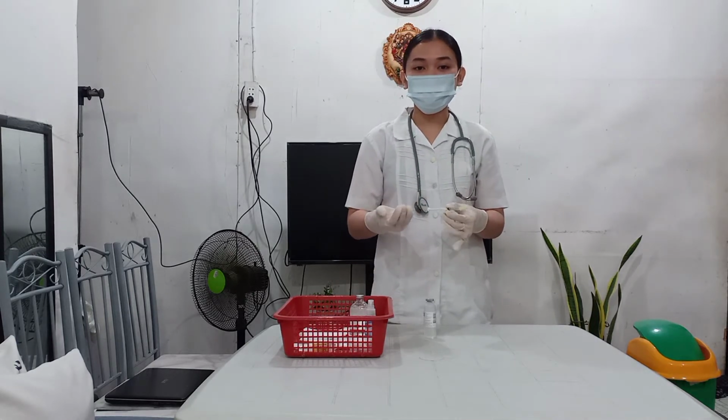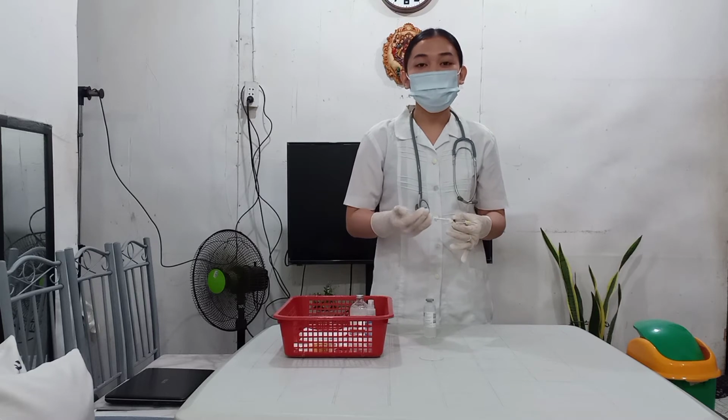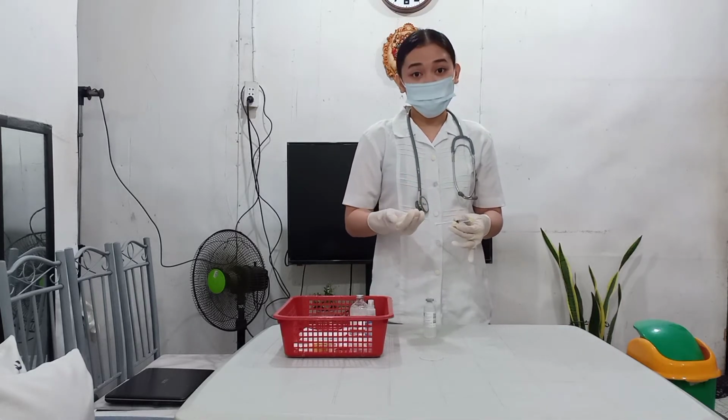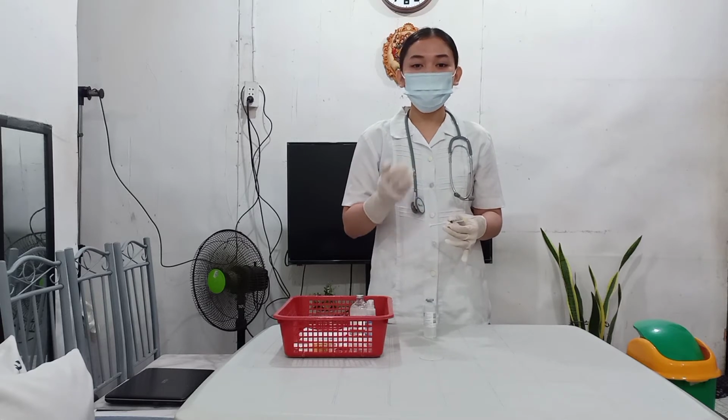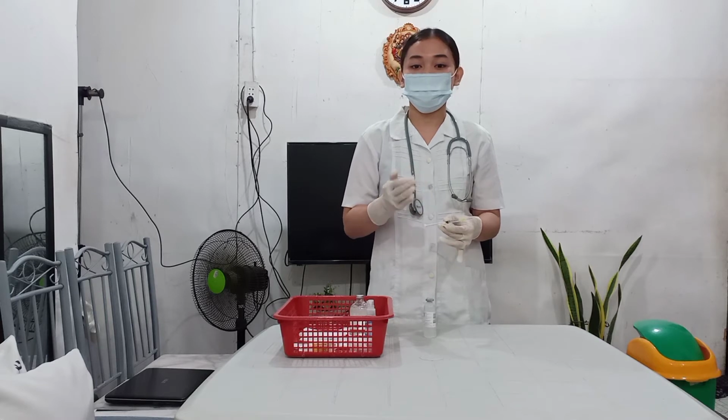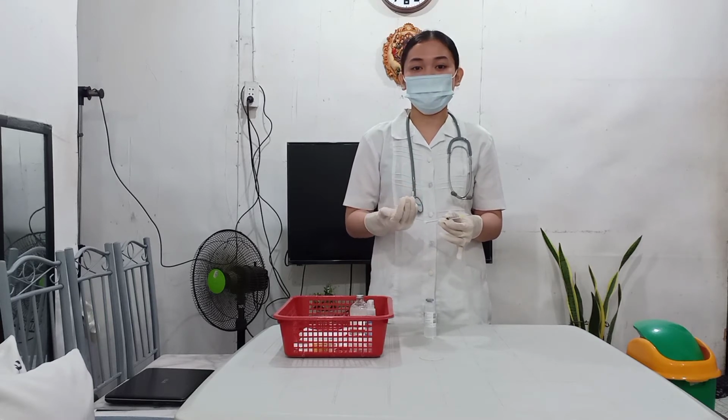Next is to dispose of the filter needle by placing it in a sharps container. The safe use and disposal of sharps will reduce the risk of injury and the acquisition of blood-borne viruses to both staff and patients.